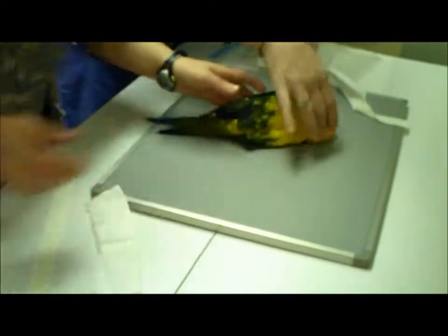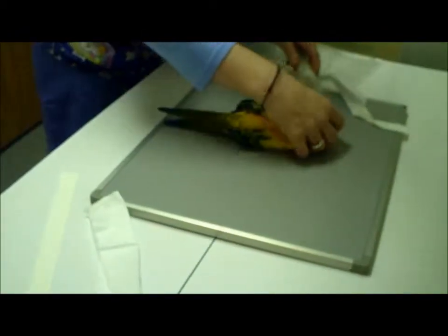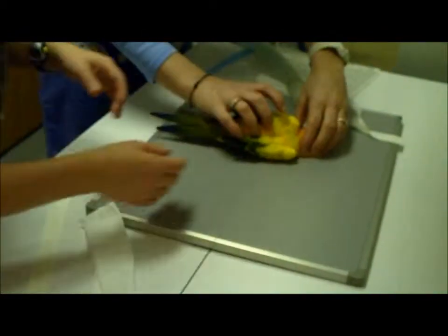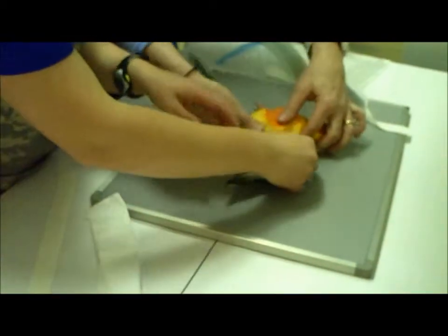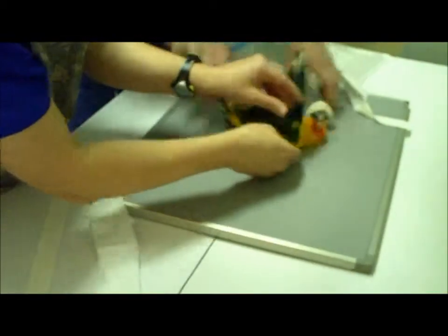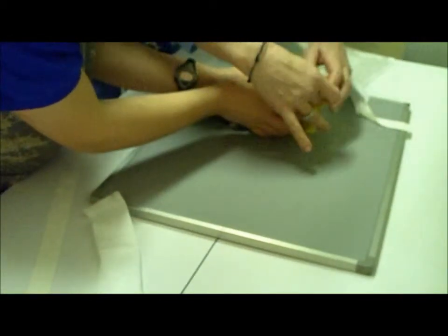Then we're going to go into the lateral view and place the patient in lateral recumbency and secure the neck, the legs, and the wings down with tape. The wings are going to be extended dorsally above and away from the patient to get a clearer view of the chest.